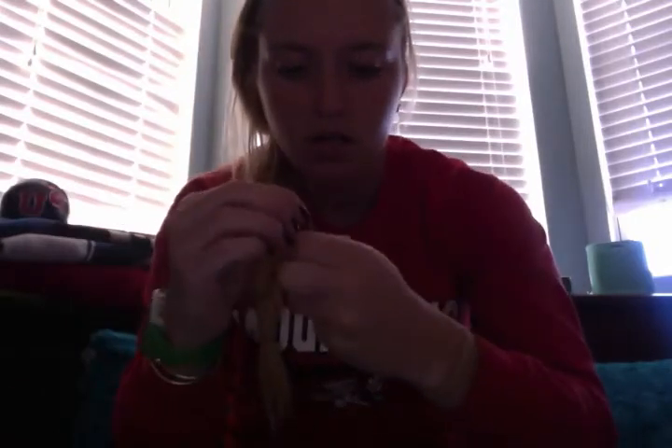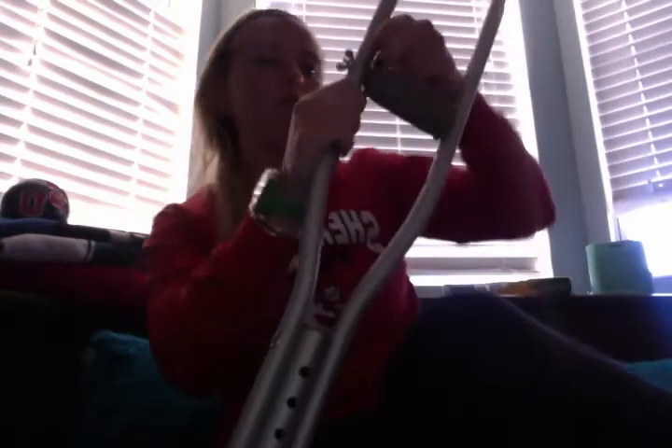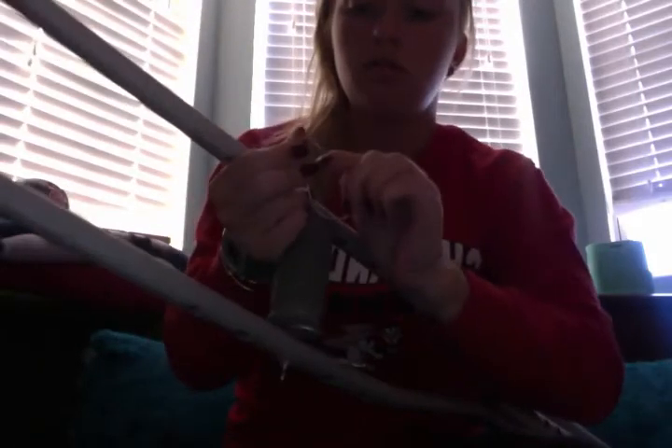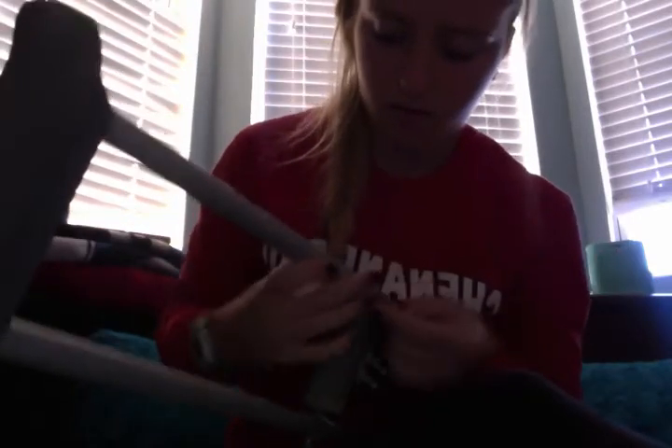The easiest way to do this is to undo your hook and attach it from the big ball side onto the crutch handle. I'll go ahead and do that with both hooks. Now both hooks are on.